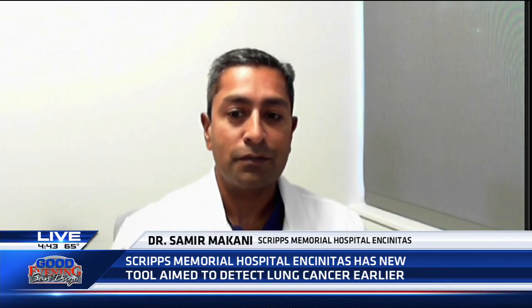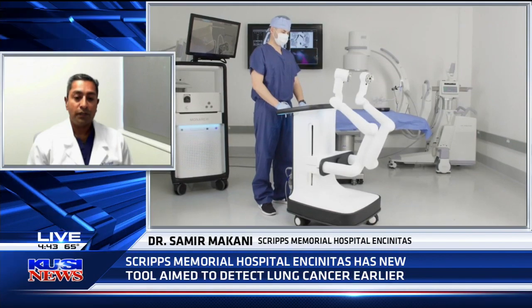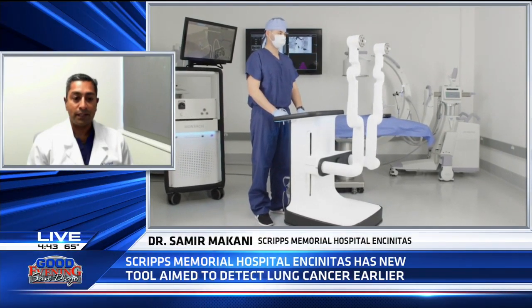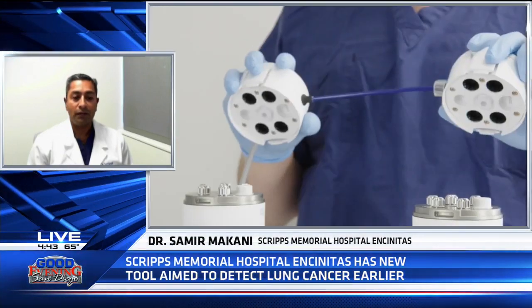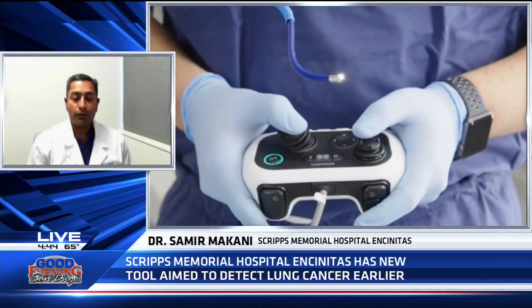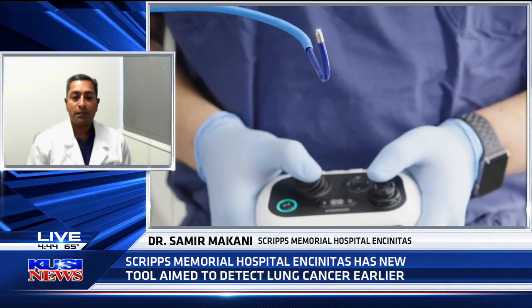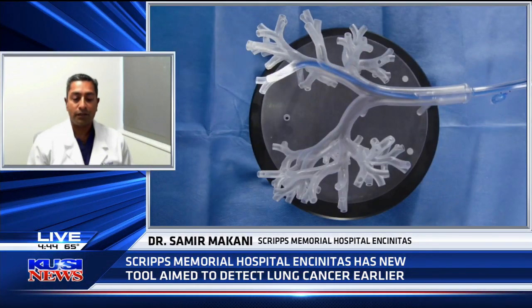Absolutely. So, we're truly excited to offer this new technology to our patients. It's a highly advanced robotic-assisted system for diagnosing various lung diseases, including lung cancer. Traditionally, bronchoscopy has been around since the 1970s. It's done through a procedure where we use a tube to enter through the mouth and go into the throat and then back into the lungs. But it had its limitations based on vision and access to different portions.